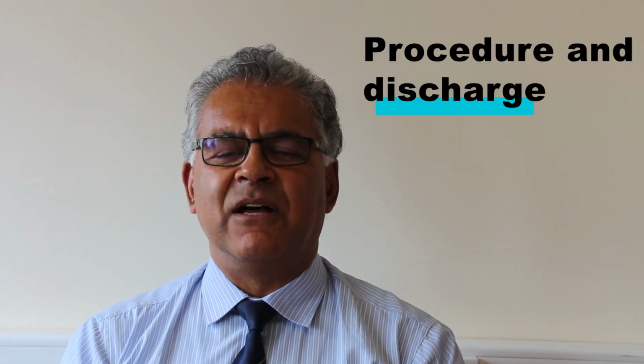The procedure itself, you'll be taken into the endoscopy room. You'll be greeted by the endoscopy team. We will give you some sedation and pain relief to make the procedure as comfortable as possible. The procedure overall takes about 30 minutes. We use X-rays to position the balloon in the safest possible way to perform the dilatation.